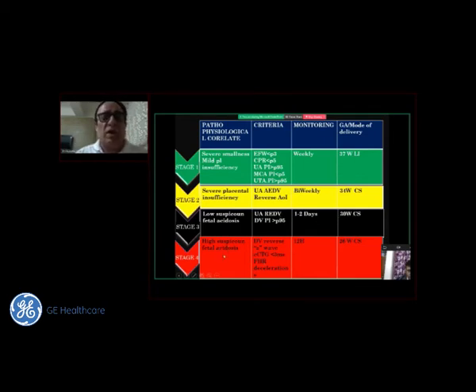And of course, if you have stage 4, where there is the third criteria of the TRUFFLE study, the ductus venosus A wave reversal, and that needs intense monitoring. But if you are beyond 26 weeks, we would suggest delivery. So essentially, stage 2, stage 3, stage 4 is what you would be looking at in early FGR.